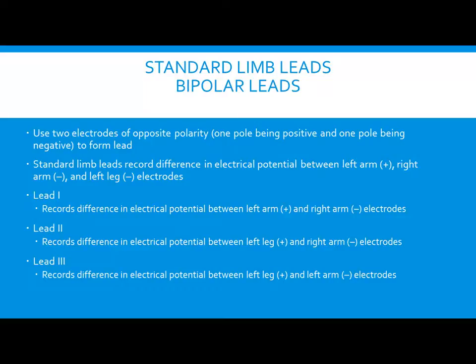Now, on our mannequins, including the other ALS mannequins, this is my 12-lead simulator here, we won't use sticky pads. We will have direct hookups to the mannequin. If and when I'm going to put the electrodes on, where am I going to stick the white one?